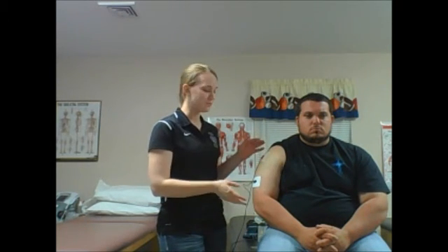All right. And while that's applying, it's going to take just about 20 minutes to apply. And there's your application. When it's all finished, and as you remove the pads, you want to double check and make sure that there's no irritation or anything. But also, in a preventative measure, if you know that they might have some kind of allergic reaction to the pads themselves with the adhesive, you can always help reduce that risk by increasing the size of the pad and applying a Viragel after, or even increase the spacing of the pads. And there's iontophoresis.